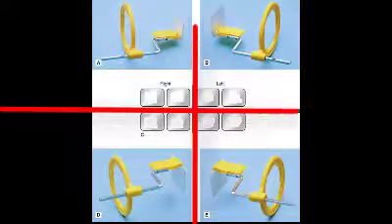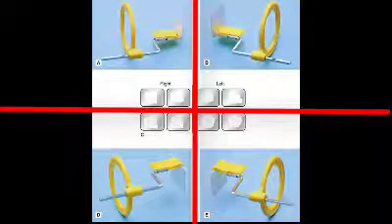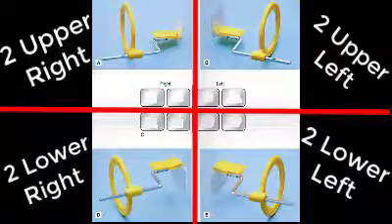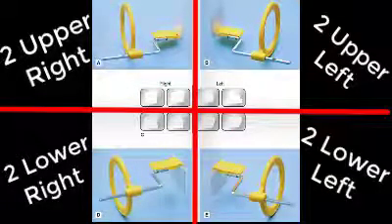the right area. A total of 8 posterior images are exposed, 4 maxillary exposures and 4 mandibular exposures. It's important to note that the same configuration used for the upper right will be used for lower left, and the same configuration used for the upper left will be used for the lower right.